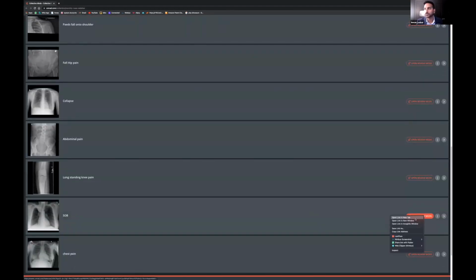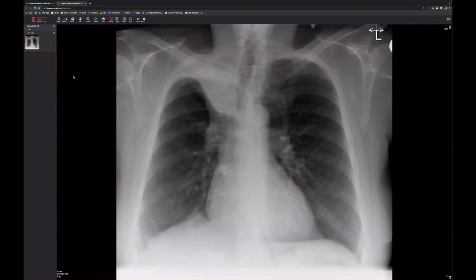Okay, so this one hopefully is a... I think there's a question. Yeah, go on. Yeah, exactly. You've done it. Yes, osteomyelitis.